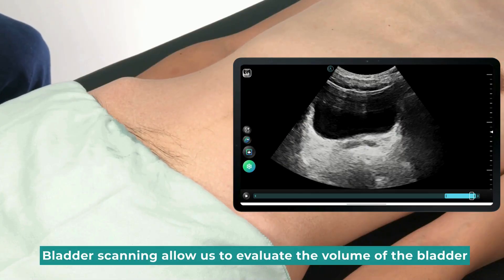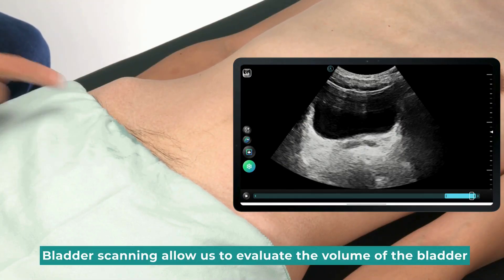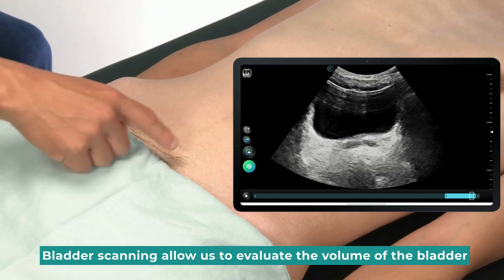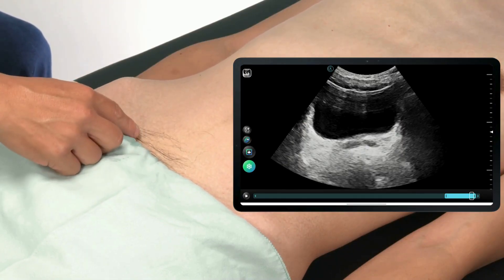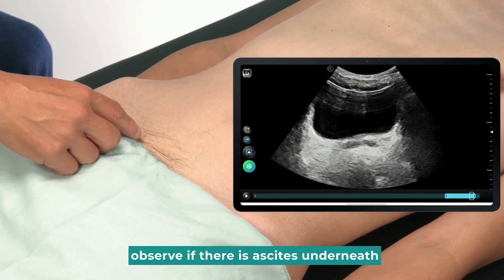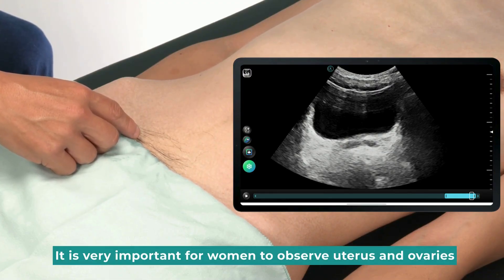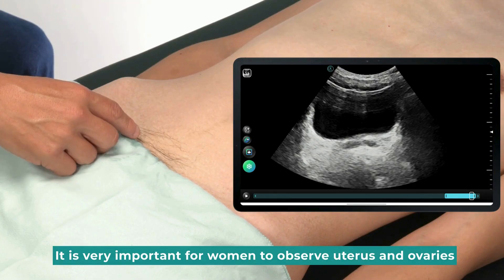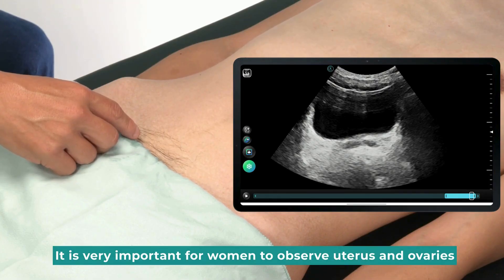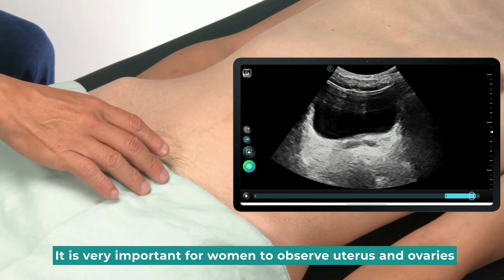Bladder scanning allows us to evaluate the volume of the bladder. We can also use the bladder as a window to observe if there is ascites underneath. It is very important for women to observe the uterus and ovaries.